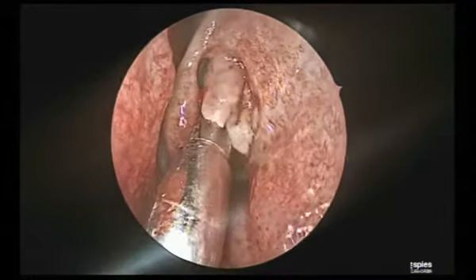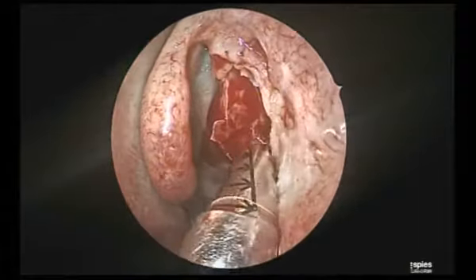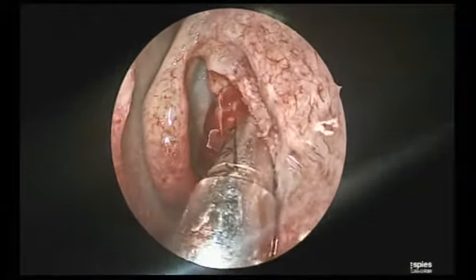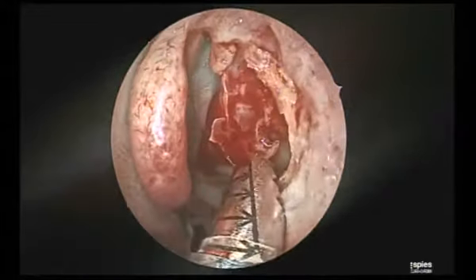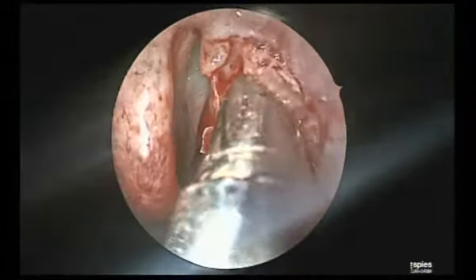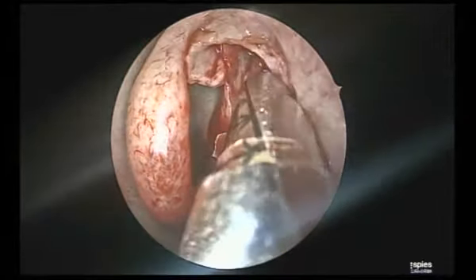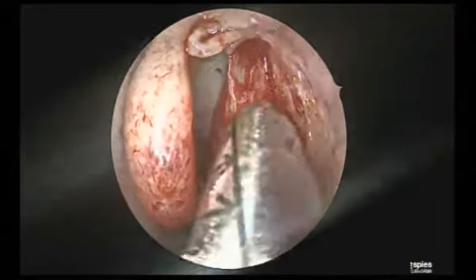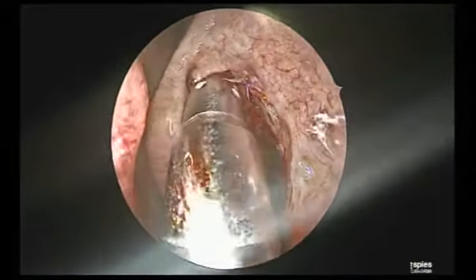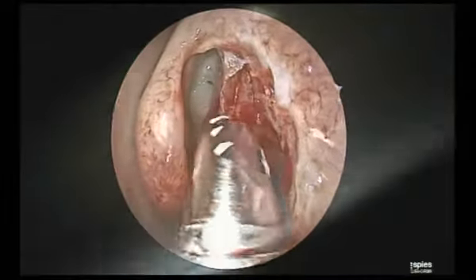You have many tools at every step. But here I again simply use the micro debrider. Because it has got mobilized, now it gets sucked into the debrider, and therefore whatever can get sucked, only that can get debrided. And the best thing about the use of debrider is don't press anywhere. It will not work. See, just go close to it, and your blade will cut and suck. You don't have to go.